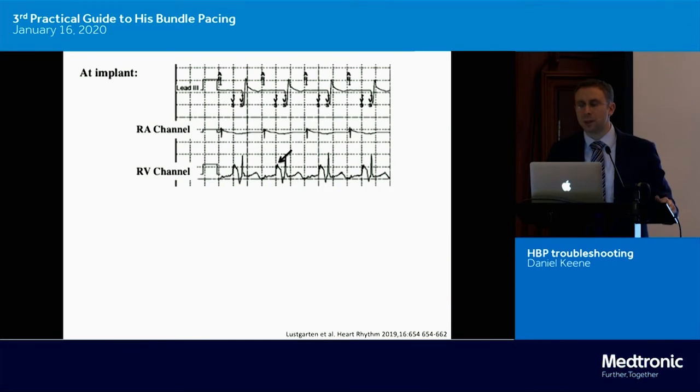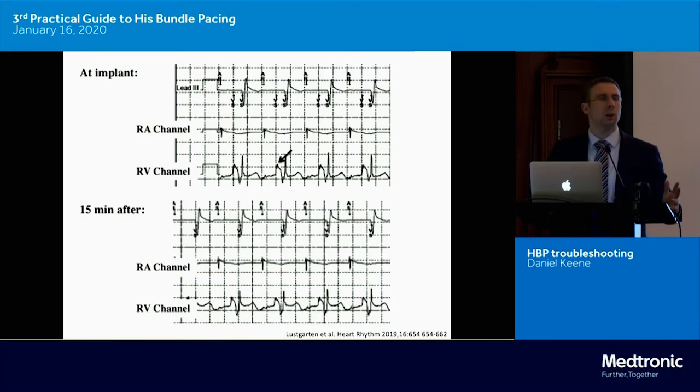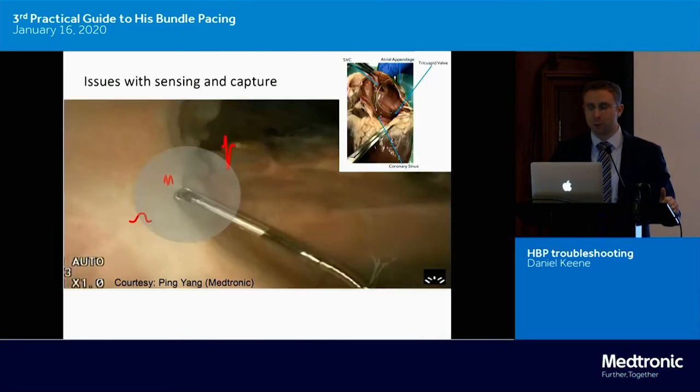Now, it's possible that if this is an issue immediately after deploying the lead, that actually this could result from your His injury current, as you can see here. And actually, don't move the lead straight away. Wait, as quite often this injury current will resolve within 10, 15 minutes and then won't affect your sensing anymore.